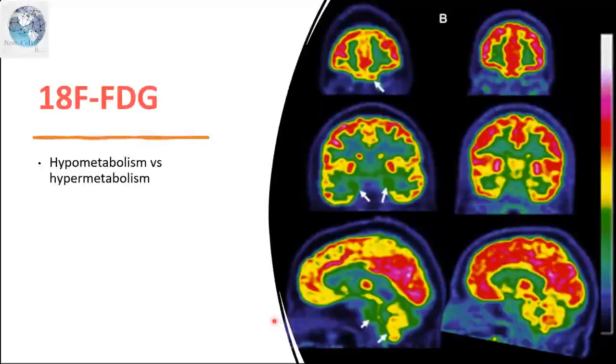Basically every area is lighting up, but there are softwares that can actually do thresholding. It will look at an atlas, a population of this many people, and how their brain glucose pattern is. So for the person we're going to test, if their range falls 2 standard deviations below or above the normal range, then you will say either hypo or hypermetabolism. The brain maps are then developed to highlight not all the activity, but just where it is above or below the normal population. So you can see regions that are more focused, and it is easier to interpret, more like a semi-quantitative method.